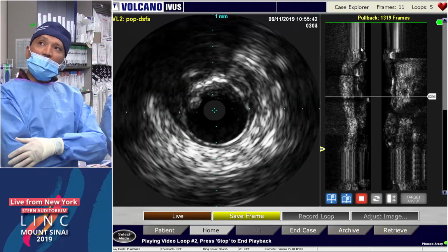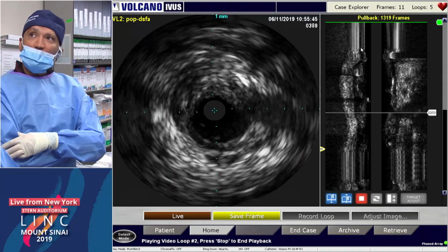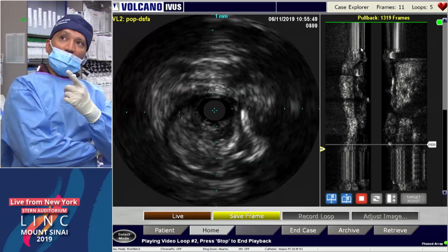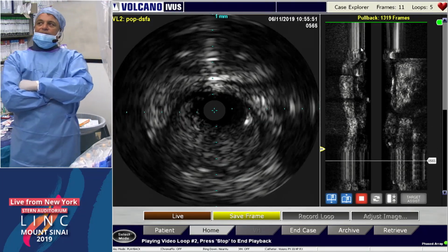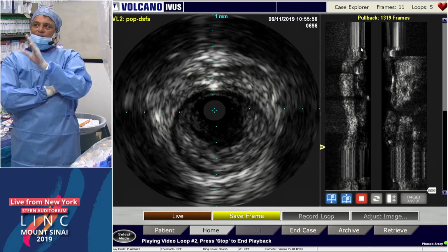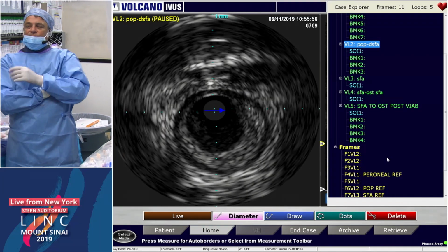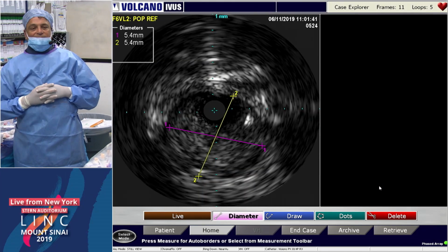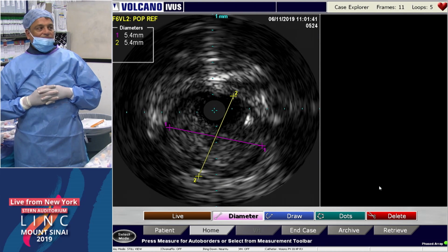I think in one area, this is the focal. That was the only cut we did. And right here, it's very soft and very much around the catheter. But it's still eccentric though, Karthik. And the problem with the Hawk device is we're not able to direct it towards what we wanted. Right, and that's why I asked Brian that question, because sometimes when you do one cut, you get surprised that you didn't cut where you wanted, and that's what happened.